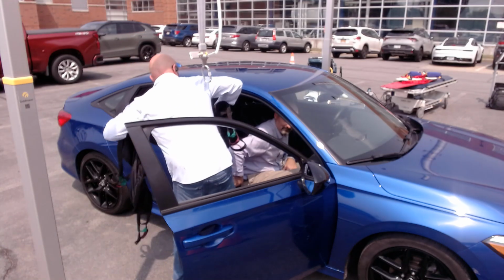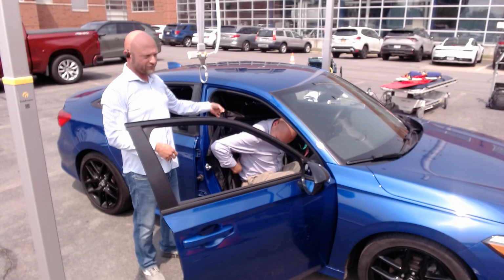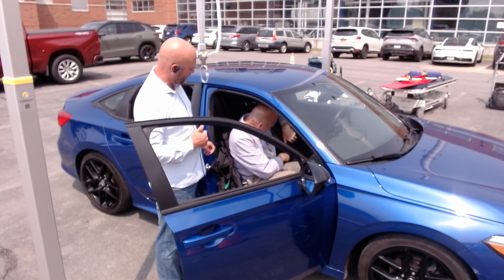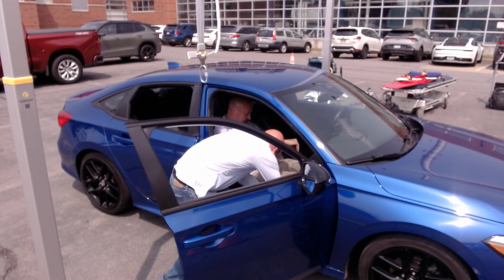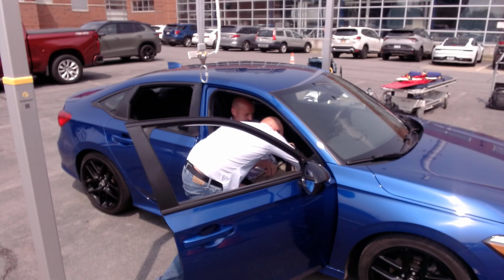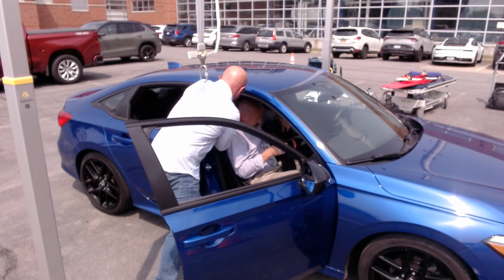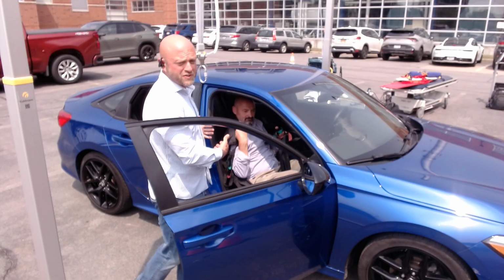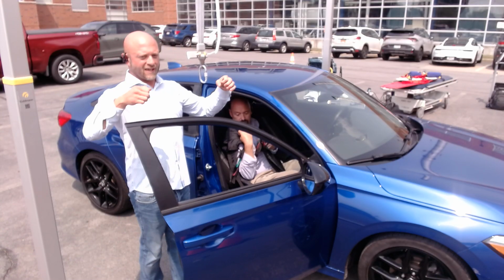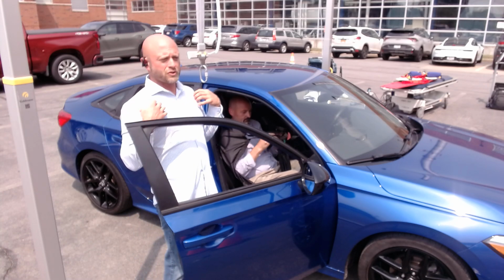So our patient, while they need a dependent lift to get out of the vehicle, they're also able to help apply the sling. So again, when we're pulling somebody out of the vehicle, if they're really tall, Chris is pretty tall, we may want to use those longer straps on the shoulders to lean his shoulders back.